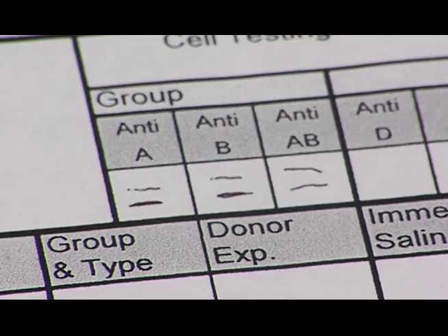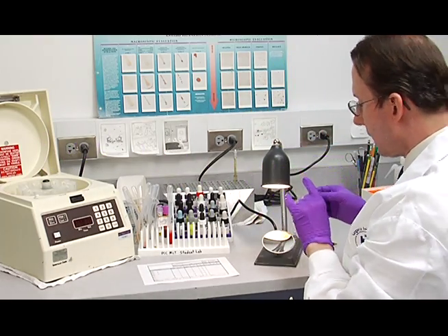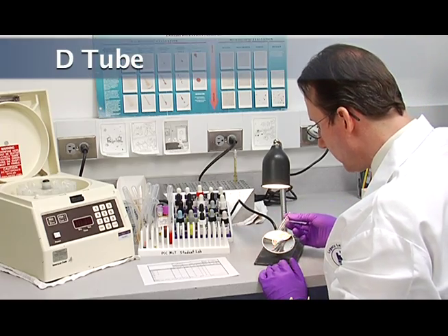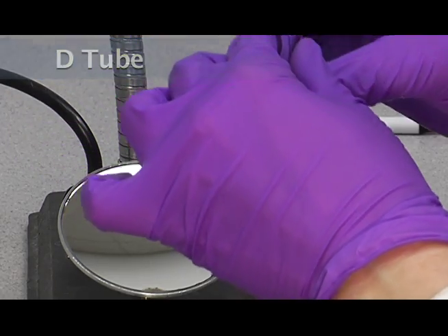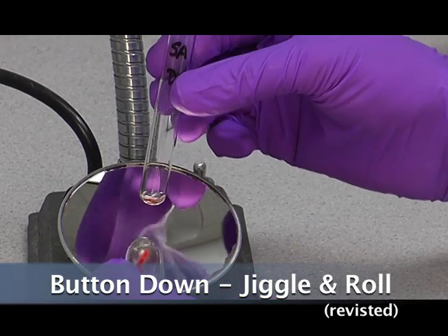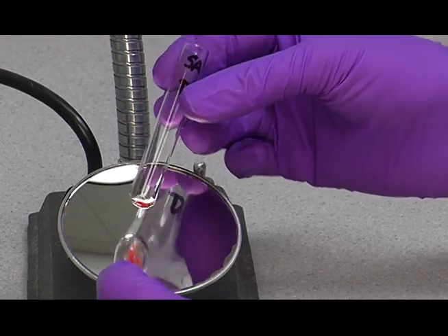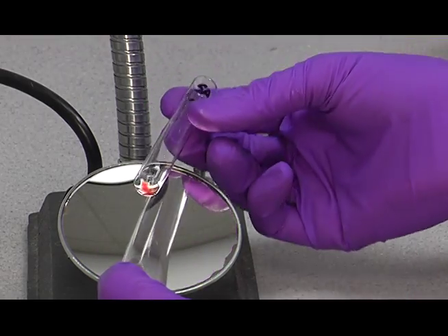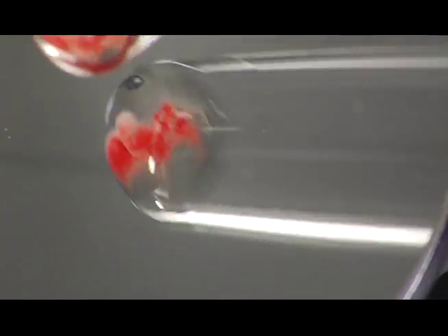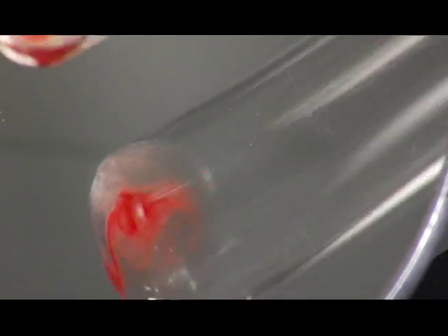And go on to the next tube, which is the D-typing. This is a technique that works well for left-handed individuals. We're going to put the button completely over on the other side opposite the mirror, and a jiggle and rolling it down like this.